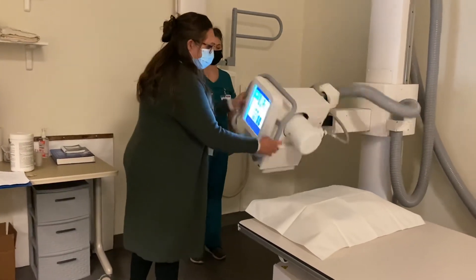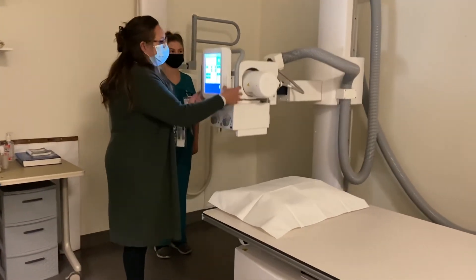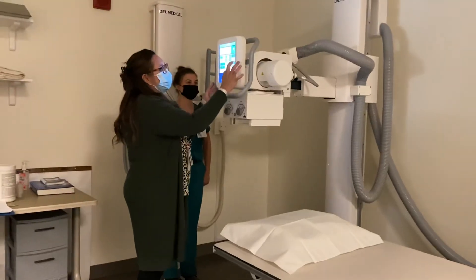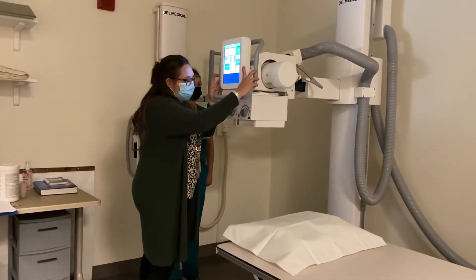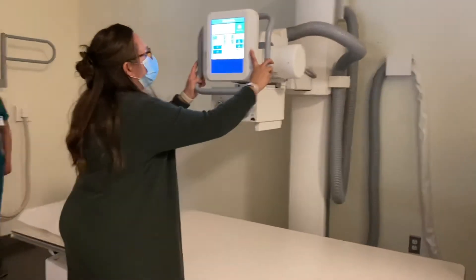I'm going to move my machine. After the upright, I'm going to do the supine. I'm going to angle my tube towards the table and change my detector to table. I want to bring it all the way down to the feet so that my patient can easily get on the table without hitting their head.